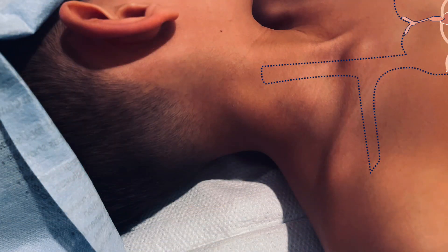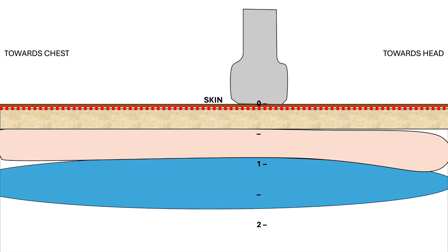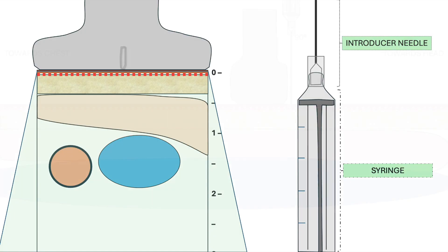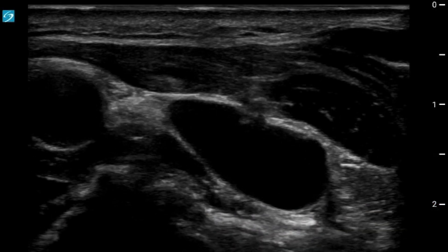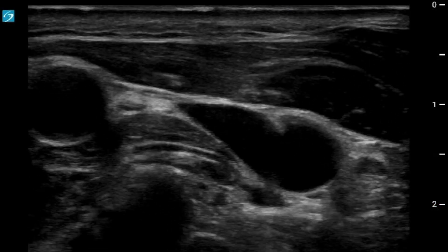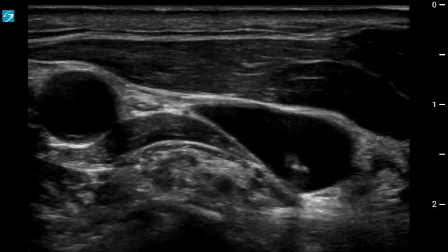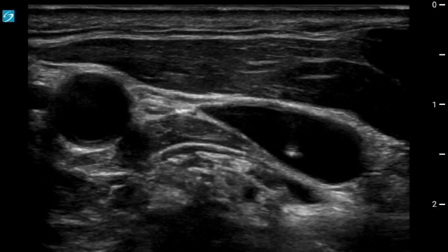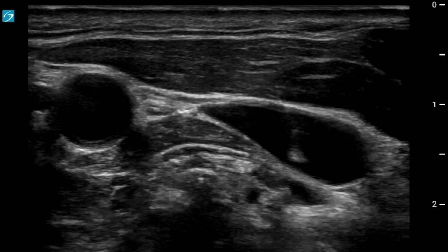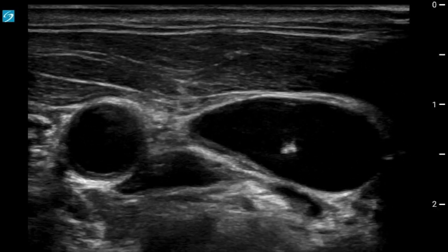I then carefully drape the patient and cover my ultrasound probe. Now, the skin is tough to get through, so I get through it with my introducer needle and syringe at a steep angle, and I then advance with negative aspiration. During this time, I appreciate how easily the vein is compressed, so when I get a flash, I know the bevel tip is likely to be on the posterior wall of the vein, and I prove it under ultrasound. I then relieve my pressure on the vein so that it pumps up, and I place the needle tip in the center of the vessel.